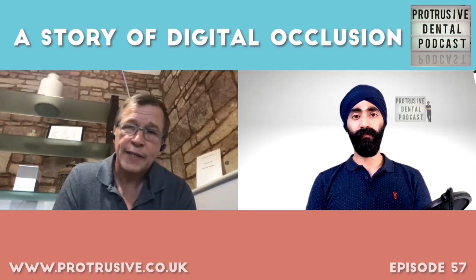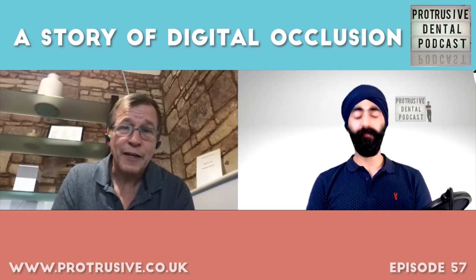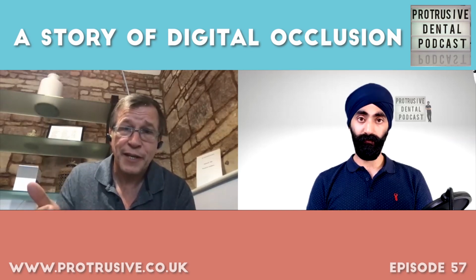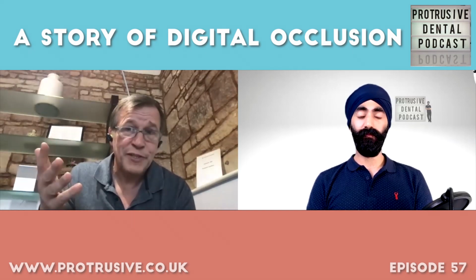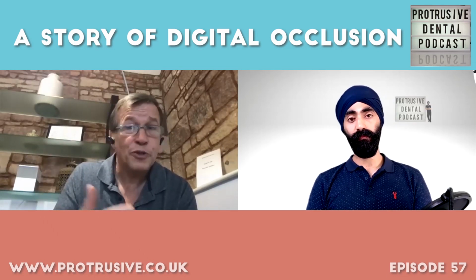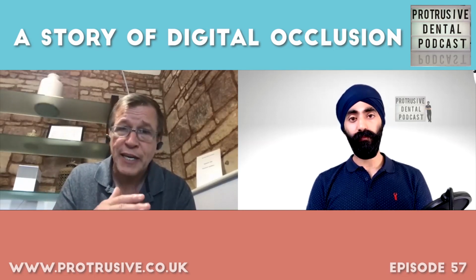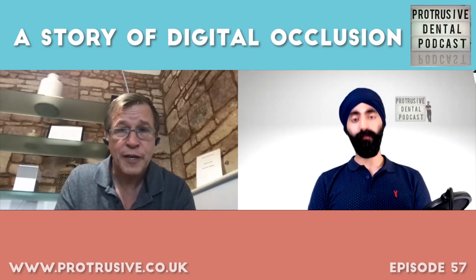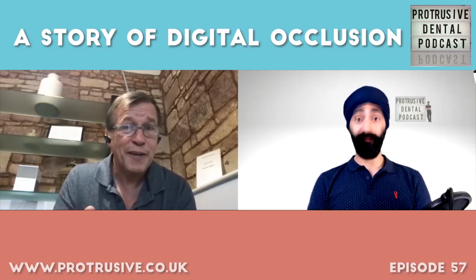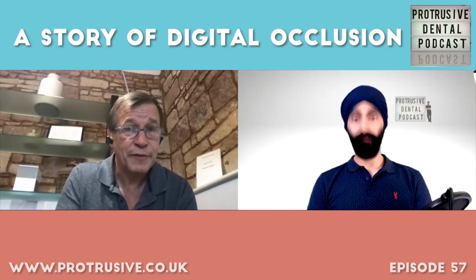Now, I think it's grossly inappropriate to be taking CBCT scans to mount models. Many of the patients that I treat have joint issues, ortho issues, implant issues, and I've got good reason to take full volume CBCTs. But I also have a lot of patients, more smile design, where it's inappropriate. So we're taking appropriate radiographs, appropriate radiation. If we have one, that's probably the most accurate way of doing it. But if we don't have one, perhaps a face scan is the most accurate way of doing it.